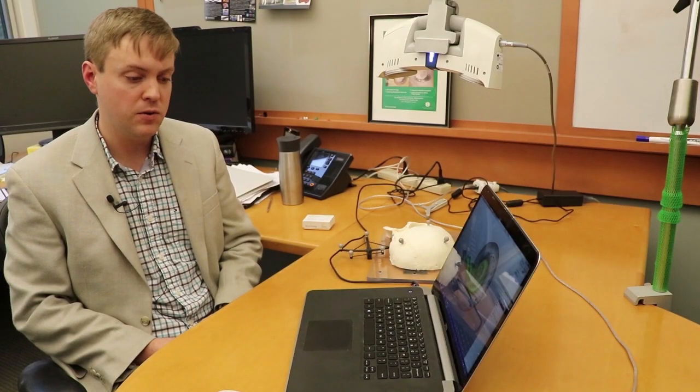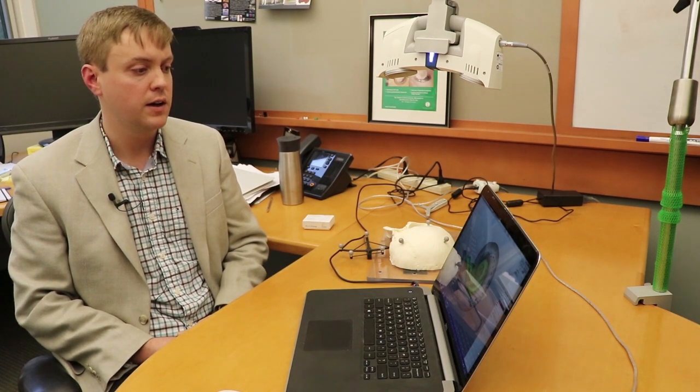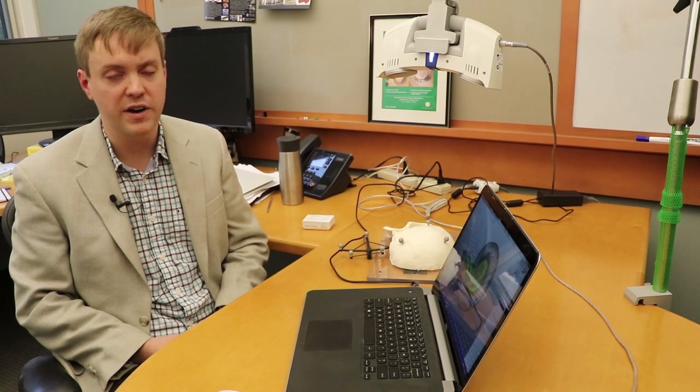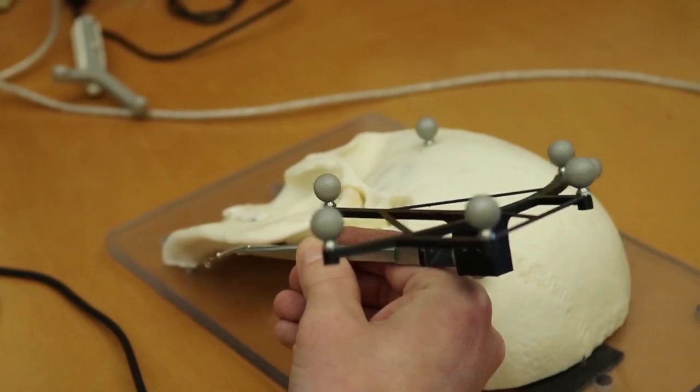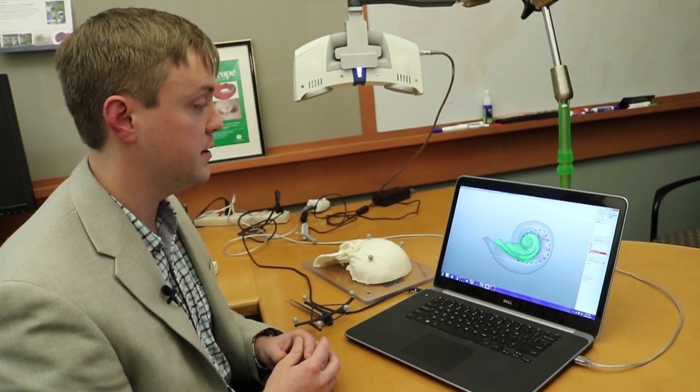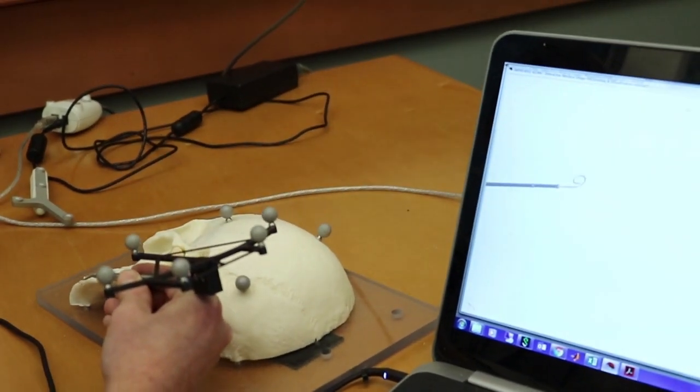So one thing my lab is doing is we're investigating ways we can help guide the surgeon when placing the electrode array to help guide the surgeon to better position the array. This is new objective information that they've never had before, and they can use it to choose settings that actually lead to significantly better hearing outcomes.